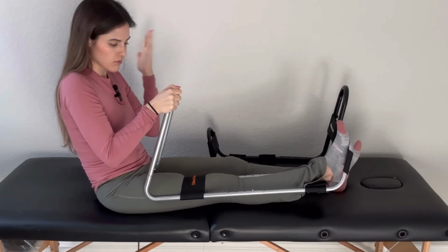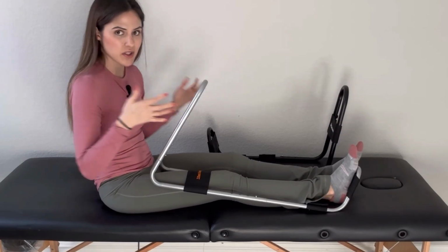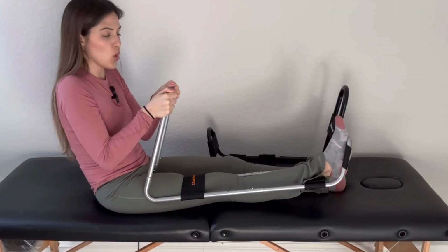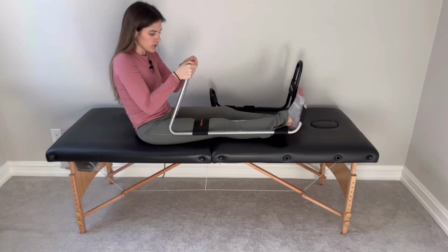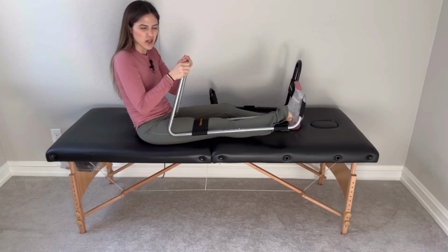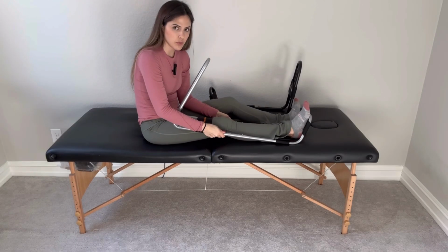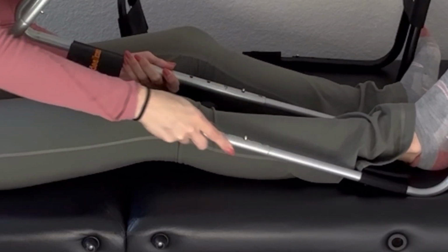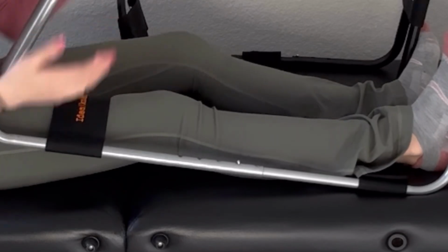Okay, so this is all you do. Your arms are going to get a workout because you're going to have to pull and hold this stretch right here. If this doesn't feel comfortable, if these bars are coming too far up into your legs, this is adjustable as well. There's little adjustments that you can make to make this device shorter or longer depending on your leg length.